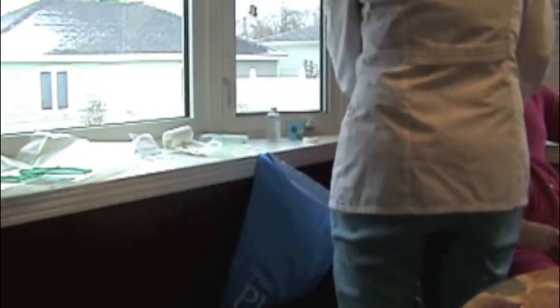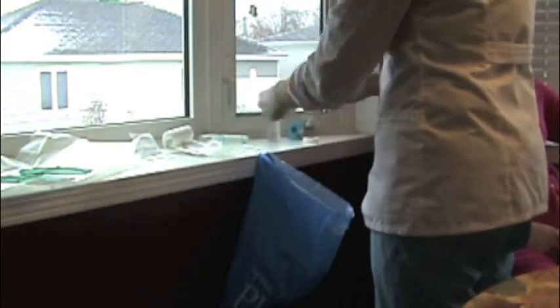Okay, there we are. Now, without turning my back on my sterile area, I can still see everything. That's clean. I'm going to fully remove the dressing from my patient. And I look at it, and it's clean. There's no drainage. The insertion site is still in there, and it's intact. I'm going to throw that away. I'm going to remove my clean gloves. Do hand hygiene.